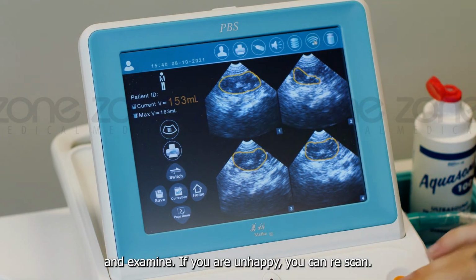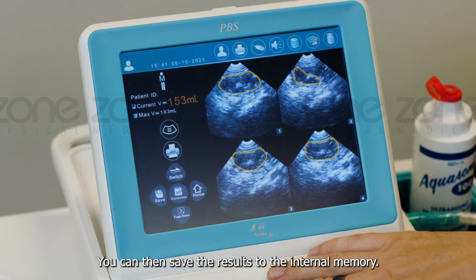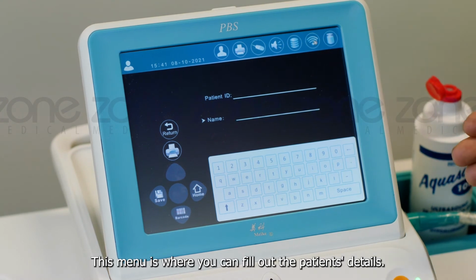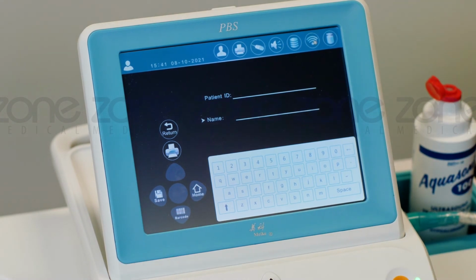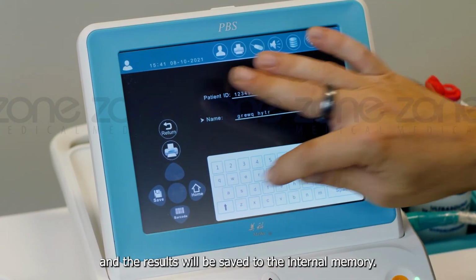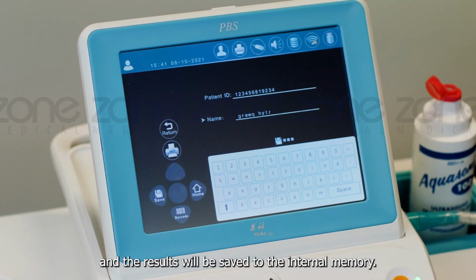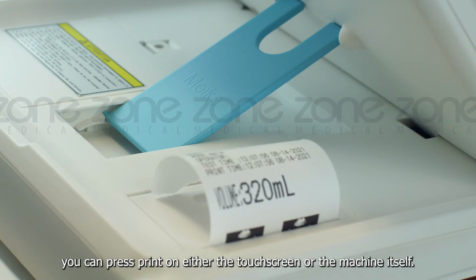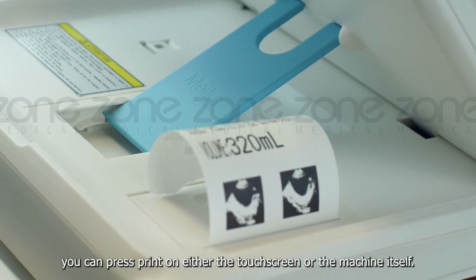If you are unhappy, you can rescan. You can then save the results to the internal memory. This menu is where you can fill out the patient's details. Once the patient's name has been entered, you can then press the Save button and the results will be saved to the internal memory. If you would like a physical copy of your results, you can press Print on either the touchscreen or the machine itself.